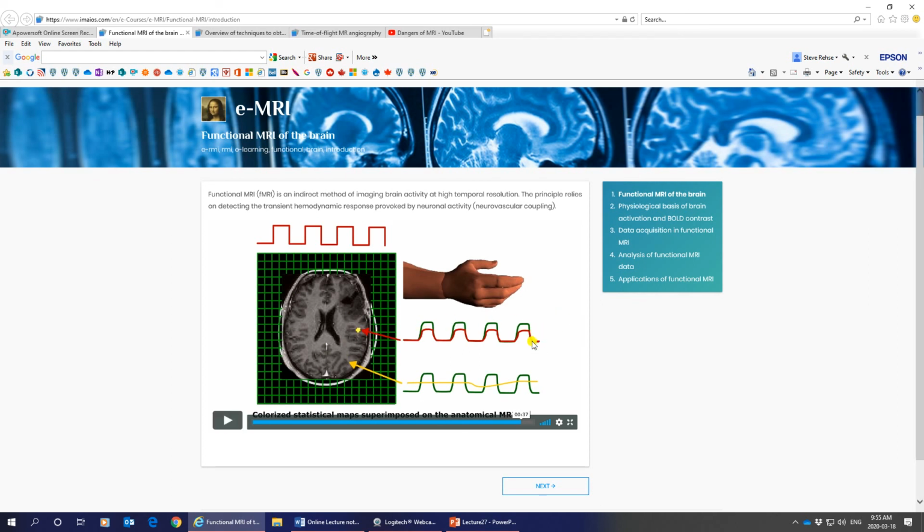So there's no way I can say, like, think about wiggling your thumb and get a measurement. This actually does take minutes. So although we use these super fast pulse sequences, I think they have to do these things for like 5 minutes at a time to get enough data of on, off, on, off, on, off. But eventually, you can map up the stimulus that you know with the timing of whatever is going on in the brain, and you can get a relationship, and you can kind of start to tell where in the brain these things are occurring. And that's called functional MRI. That's how it works. It's a really, really super cool tool.